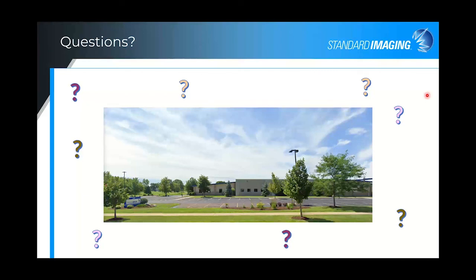What can we do as a better commissioning test for using the log files? Well, I've seen a couple of interesting things out recently in some journal articles. One group in particular used their EPID panels, and they determined that just straight use of the EPID panel comparison was not giving a true representation of the leaf position.